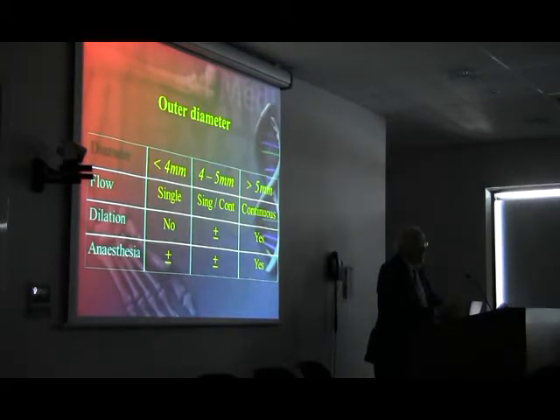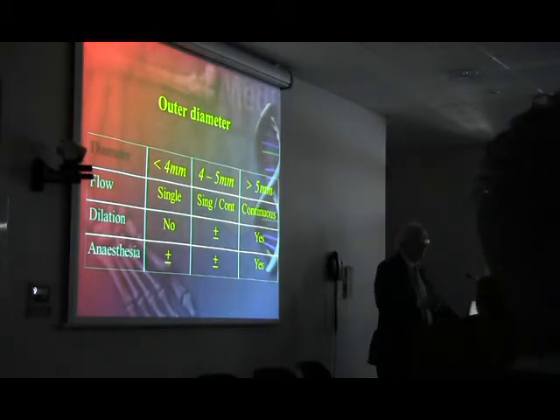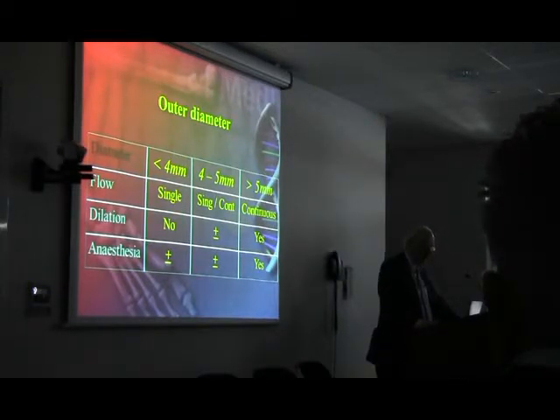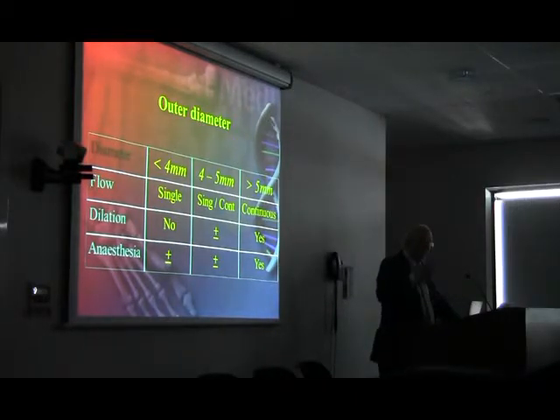In some ways, if you're getting to greater than 5, as we're getting now with the morcellator equipment and where you're adding different bits and pieces onto it, the scopes are beginning to creep up again to about 6 and a bit. So you're pushing the boundaries of what the woman can tolerate. I'd be interested to hear from our later speakers how they're going to address that and get the scopes back to where we want them, back to the 5 millimeter.